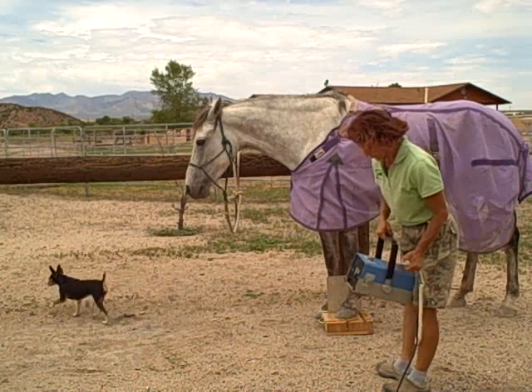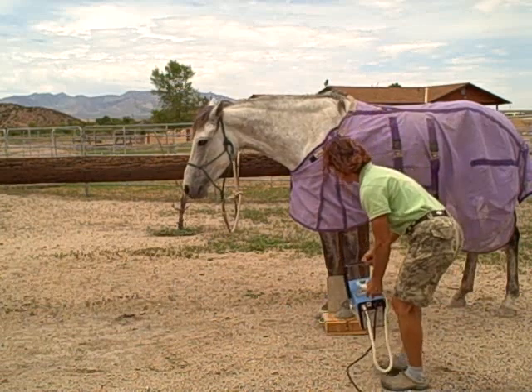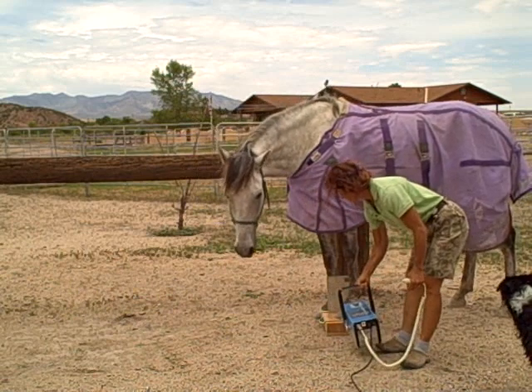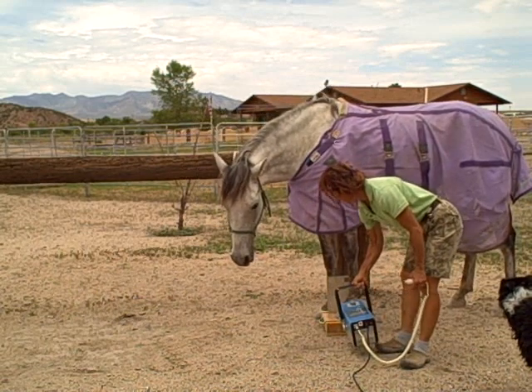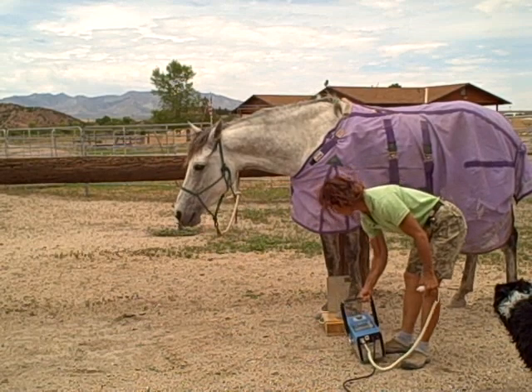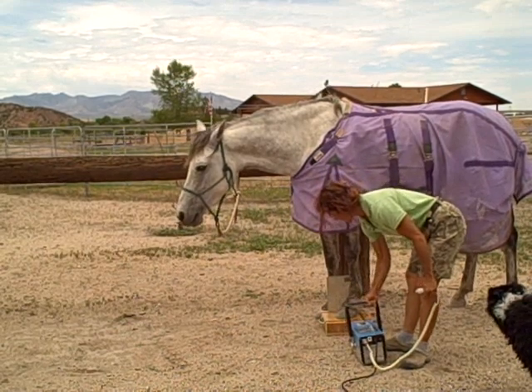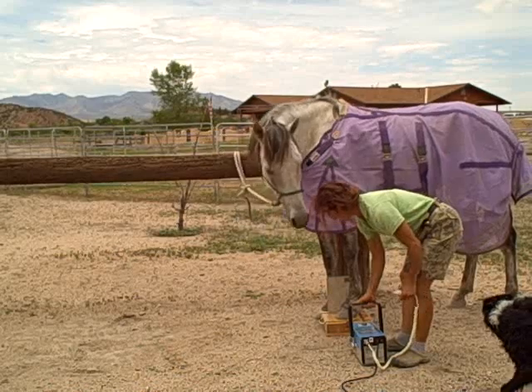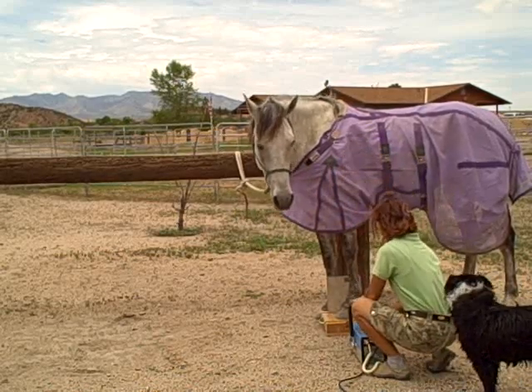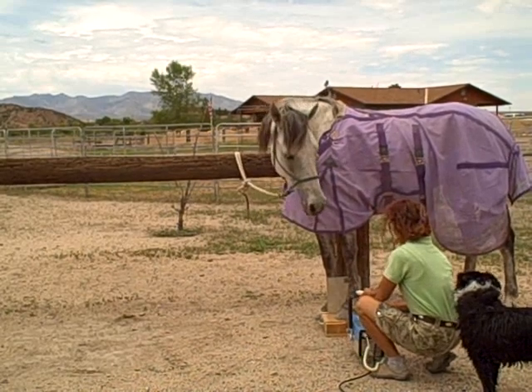The main thing is to halfway press the plunger so you get two red dots. I don't even know if you can see that, but when the two red dots come together on the cassette, you're at the right distance. And then you use your crosshairs to get your alignment onto whatever part you're taking.